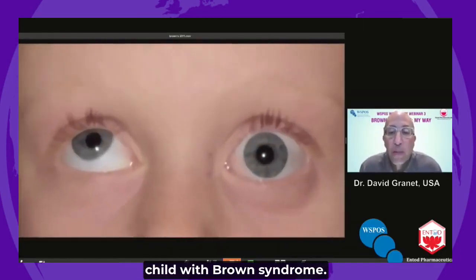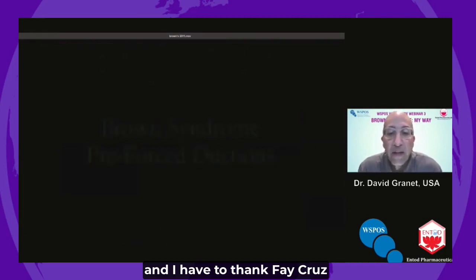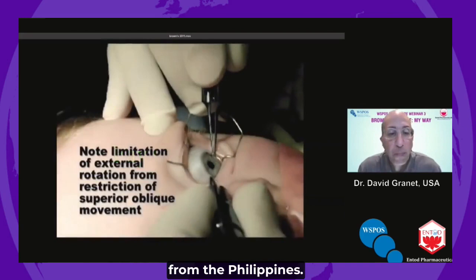You'll see force ductions in a child with Brown syndrome. I have to thank Faye Cruz from the Philippines for her help with this.